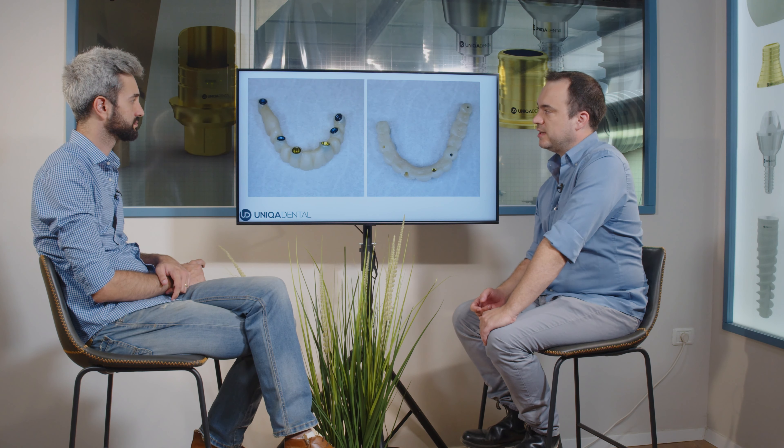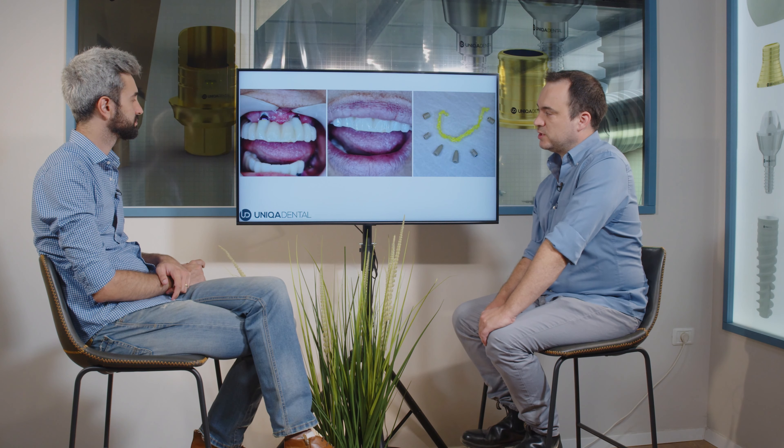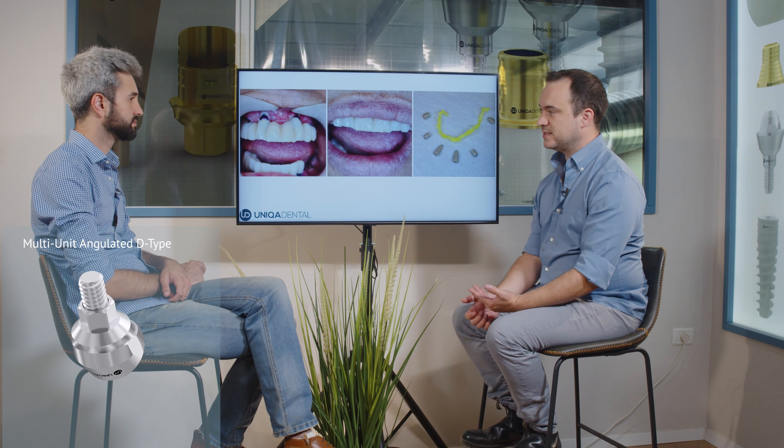This is the bridge that was eventually made — the bridge on six implants. The implants were placed in regions where we had bone and where the old implants were placed, so we didn't have much of a choice. We took the design of the old denture and using this design we designed the temporary bridge for the upper jaw. You can see the angulated multi-units sticking out of the gingiva, but we don't have any other option because the implant itself is outside the gingiva.